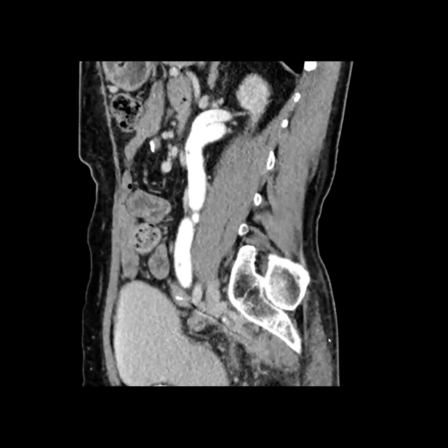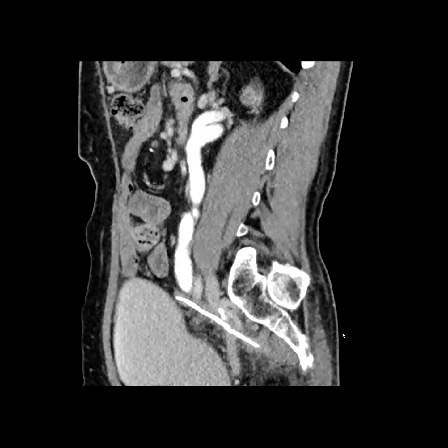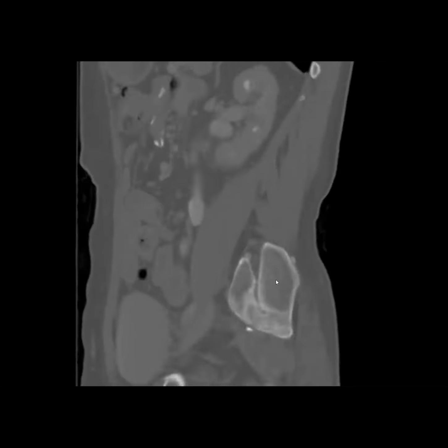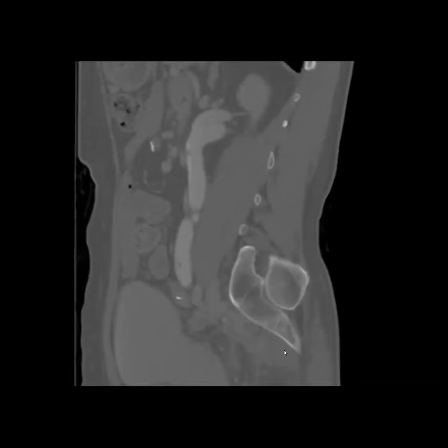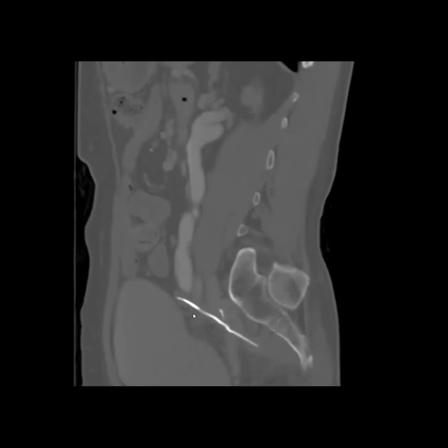I don't know if this patient has a surgical history. They don't have a surgical history. What do you think this is? It's like going into the bowel anteriorly. Yep, exactly. It's coming from the bowel, actually. It went outside, and then it goes into that presacral space where it was causing soft tissue thickening. Look at the shape of it.